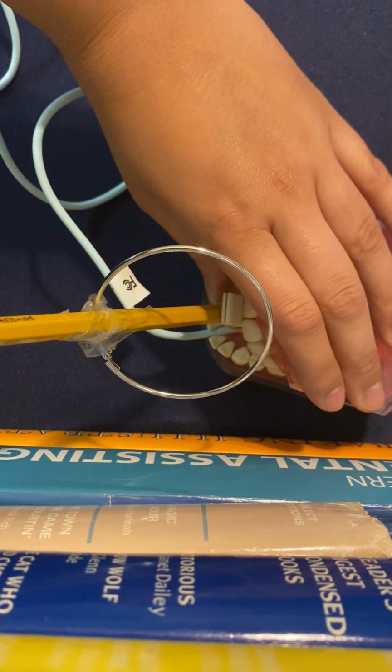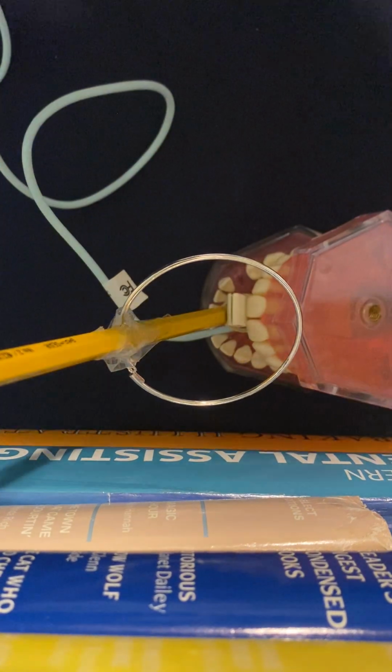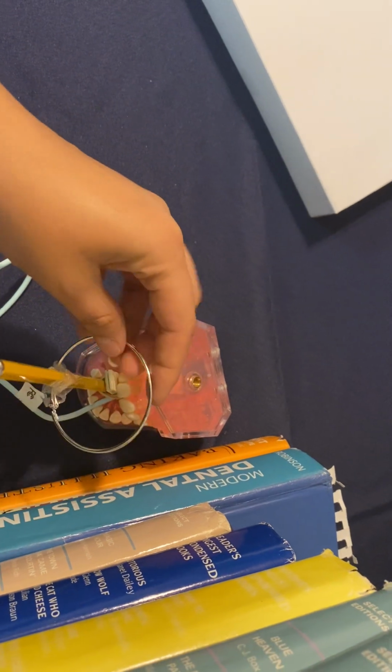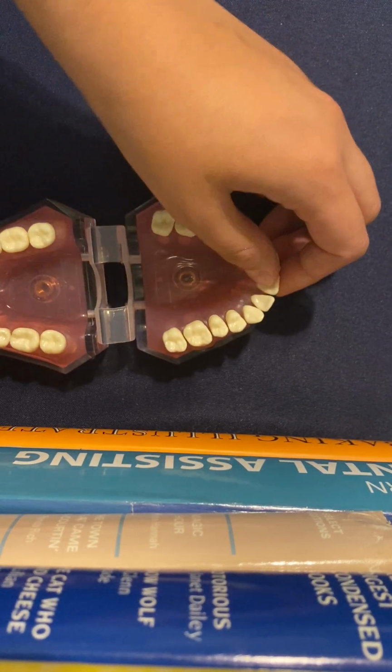And for the central ray, you're going to want the tip of the nose. So see if I can get that. This part would be his tip of his nose, so you're definitely going to be at a more downward angle. Right in there, kind of.